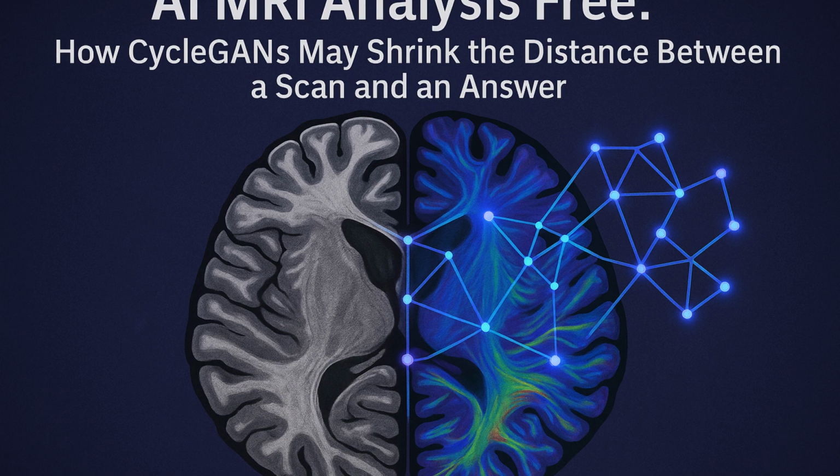And the usual way to get these FA maps involves diffusion scans, right? Correct. Which anyone who's done it knows can add significant time to the MRI. Easily 15 minutes or more inside the tube. Definitely. And more time often means more cost. Nobody wants that, especially with medical billing concerns. Yeah, precisely. Diffusion scans need specific imaging sequences. Not all machines can even do them. And they definitely increase the scan duration and the complexity.